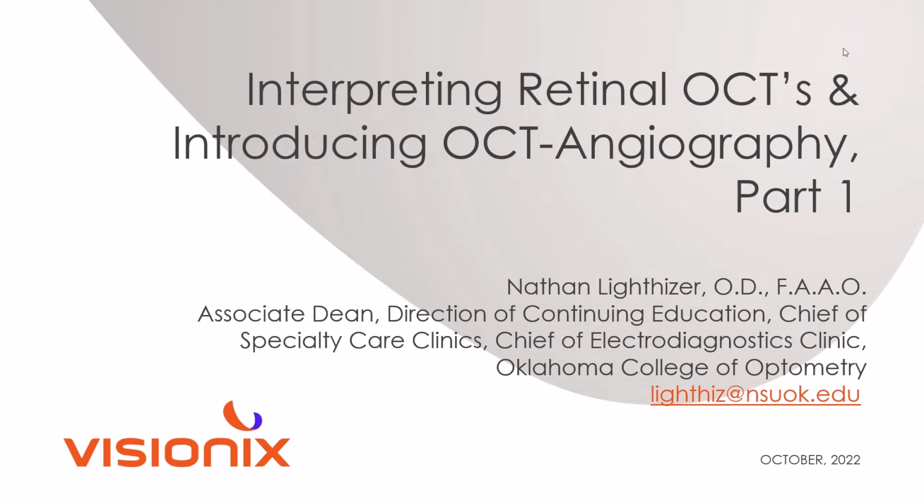In fact, I was looking through our archives today. The interpretation of OCTs actually makes up our most popular series on ODwire. We actually have one OCT webinar that has been viewed over 600,000 times on ODwire. So our most popular piece of footage ever was one of those.